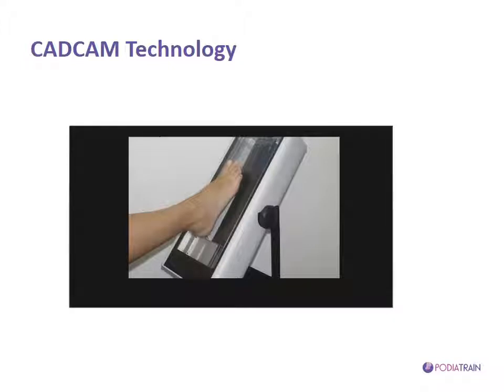First of all, there is sub-millimetric accuracy, which means that when you manufacture an orthotic, it can be really accurate to within a fraction of a millimeter, which surpasses the need of our patients in actual fact. So this accuracy is really needed in engineering works. However, our feet, our patients' feet will deform under pressure, and so making this sub-millimetric accuracy most of the time too much, really.